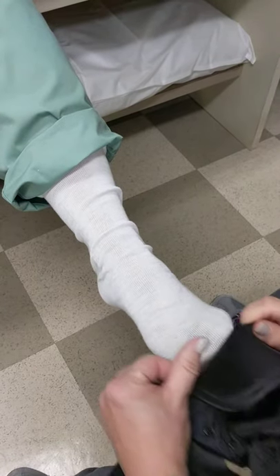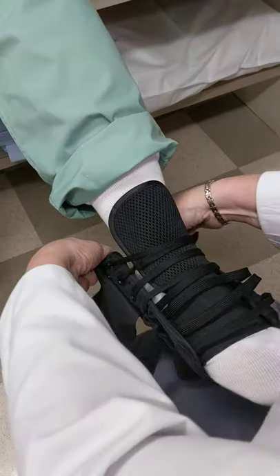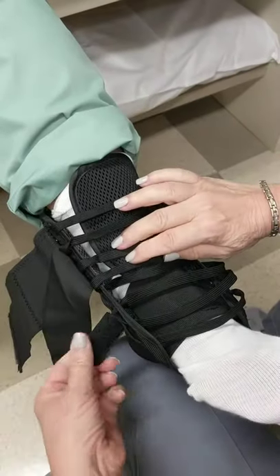Applying the ASO ankle brace. Slide the foot in, pull it up at the back, even things out.